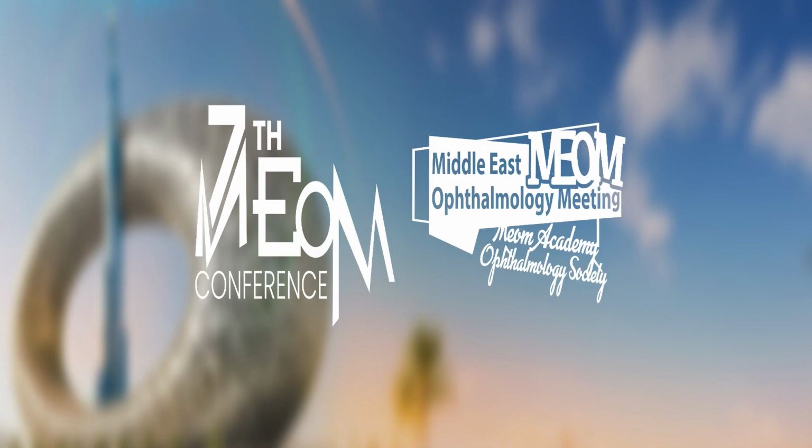I never inject fluorescein anymore for any AMD. For age-related macular degeneration, I never use it again. Even if I'm not convinced by the OCTA, I take the structural B-scan. Sometimes there is very low or stagnated flow in the choroidal neovascular membrane that I can't get. I have a huge CNV in the B-scan, I do OCTA, and I find trivial pathology.